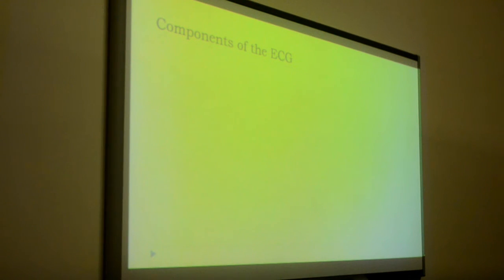So, the first thing, patient data. You want to make sure you have the right patient. It's happened before. We've seen rounds where the physicians were discussing ECGs of completely different patients, and it confuses things a lot. The second thing, any history or physical you know will help pinpoint the diagnosis, will help direct you to which abnormalities to look for, and also presents risk factors, like age could be a risk factor for arrhythmias, MIs, and other things like that.